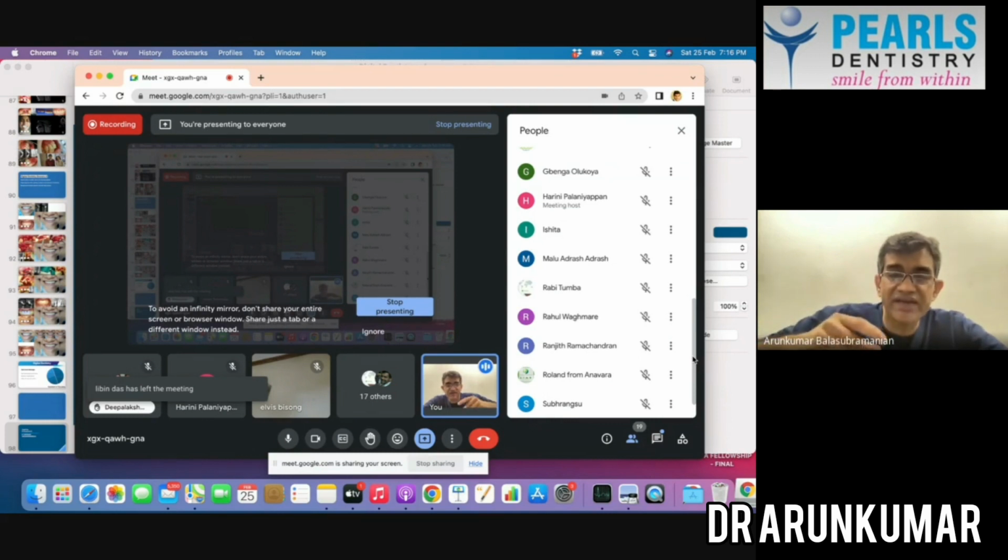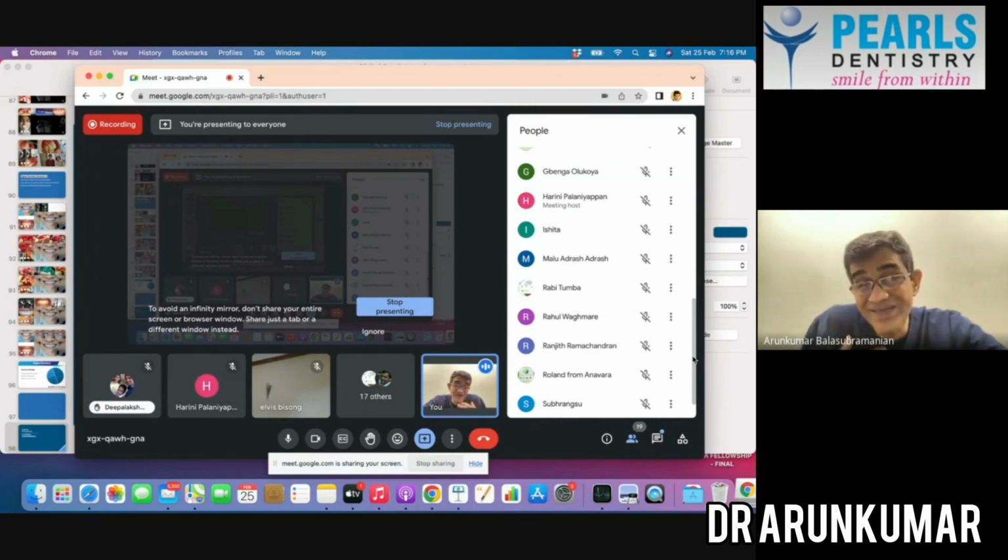Because all titanium implants function well, but what is most critical is how clean the titanium implant surface is. So when you go for these premium brands that are either European, Swiss made or US made, they undergo a lot of diligent quality control to ensure that those implants have very clean surfaces. That's one. Two, they have a lot of original research behind them. And three, most of these implants are practiced across the world. So even if you get the implant done in India, your dentist in some other part of the world might be able to attend to the implant if something is required. So that would be the best implant, if you ask me.